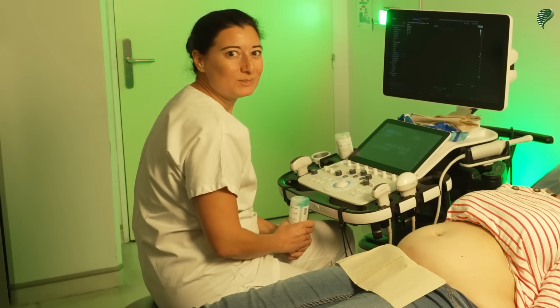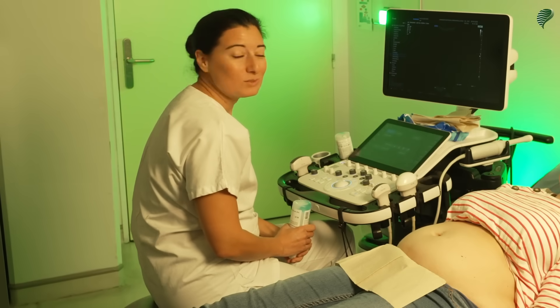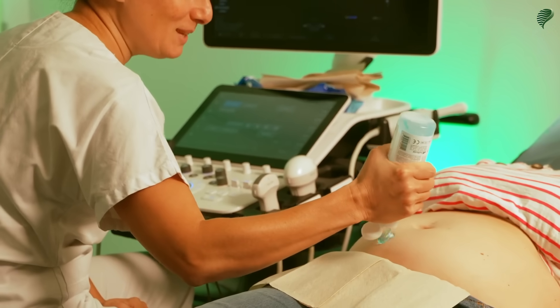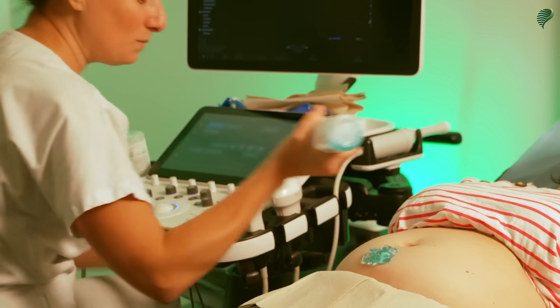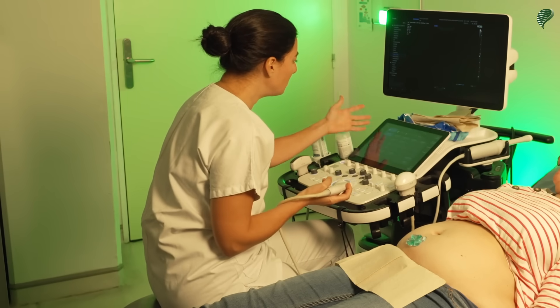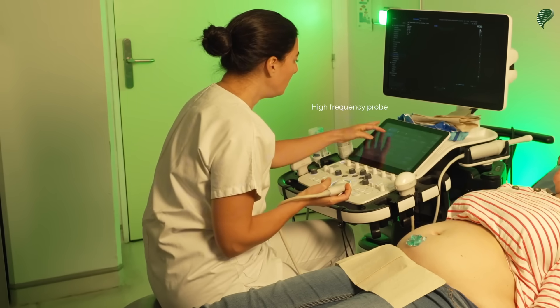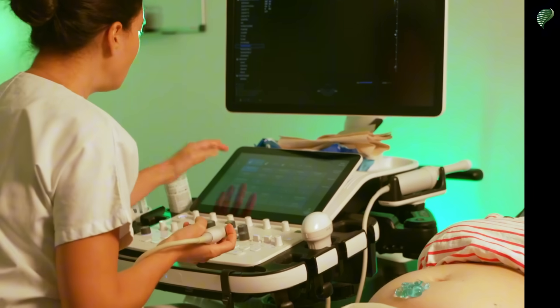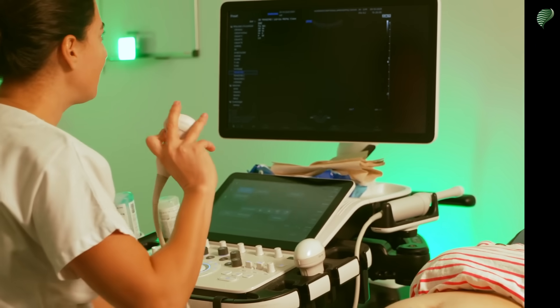Hello everyone. Today we're going to do a first trimester ultrasound exam together. I'll apply a little bit of gel — the gel has been warmed up by the machine — and we'll start by selecting the high frequency probe. We have a set of presets already available on the machine, so I'll select a first trimester preset.